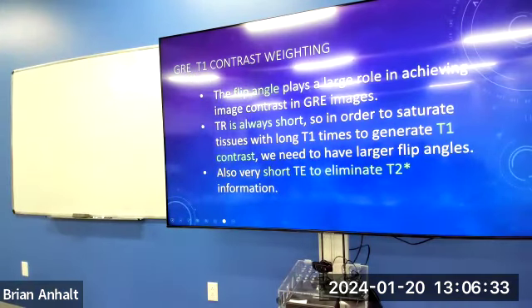So watch this. If it's always a short TR, and I want to have T1 contrast, I just prescribe it like I normally would. I just prescribe a 90-degree RF, or flip angle, right? So if I'm looking for T1 information, I'm gonna have fat recover quick, water recover slowly, we flip again, what do we got? What kind of contrast do we have here? Bright fat, dark water, T1, right? And then just listen back to the echo right away. Don't get any dephasing, that's T1 contrast, right?